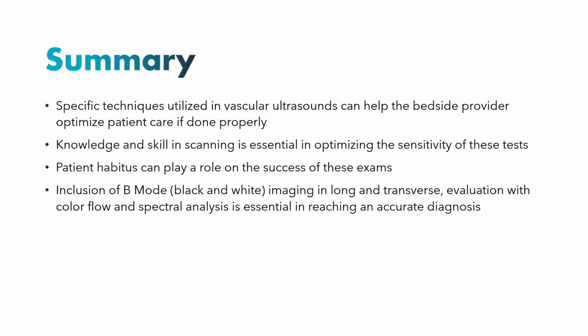And we know that patient habitus has a huge role in ultrasound. We are often limited by our patient's body type and habitus, and so understand that, as a provider, you're still not a miracle worker, so sometimes for certain patients these may not be the best tests, but they may also be the best ones you have in that capacity. Inclusion of B mode, or brightness mode, imaging when long and transverse, as well as adding evaluation with color flow and spectral analysis, is going to be essential in coming up with the most accurate diagnosis you can get.